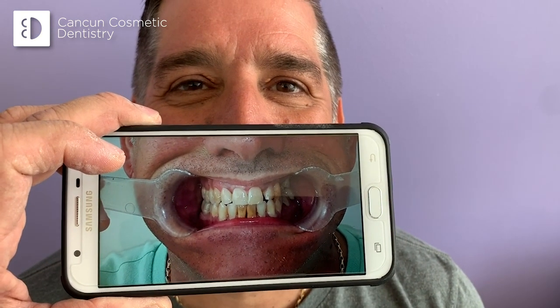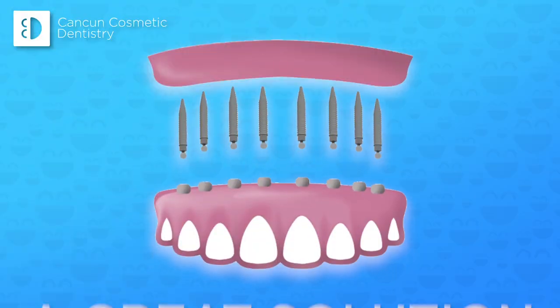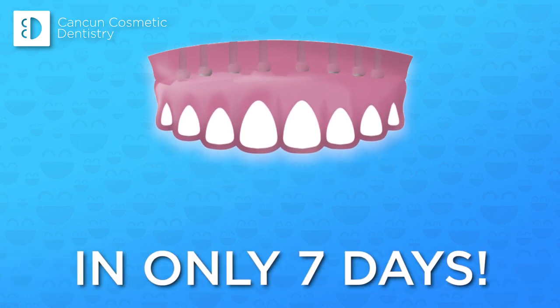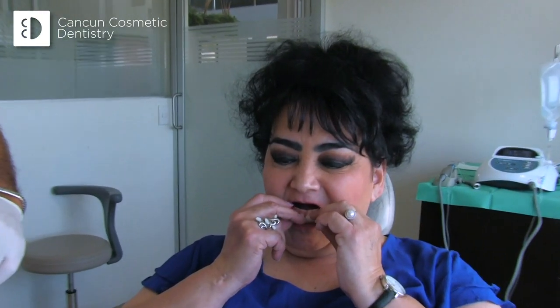You don't want to put more money on your teeth. If you say they're ugly, they're old, I don't want them anymore — well, this is a great solution. The magic about this is that you can make them in just a couple of days. It takes just a couple of seconds to put them in. It's like putting on your shoe.